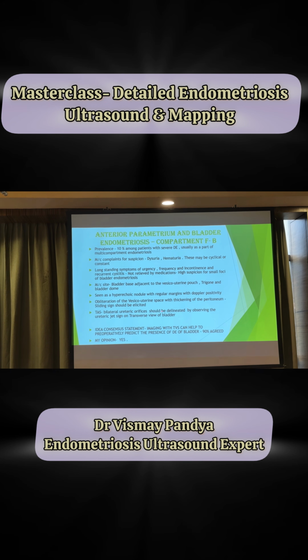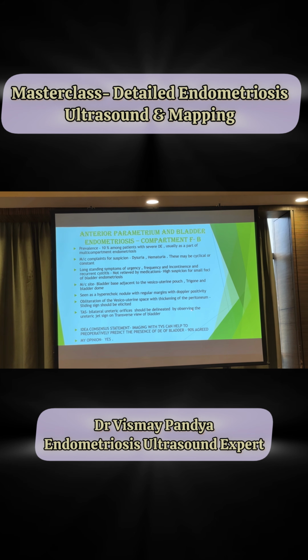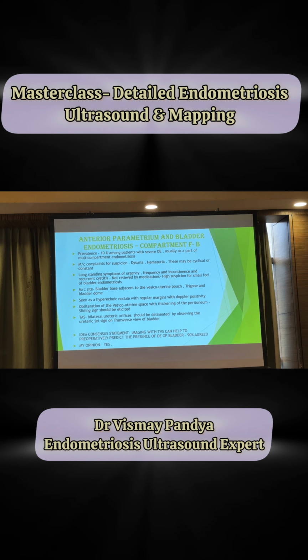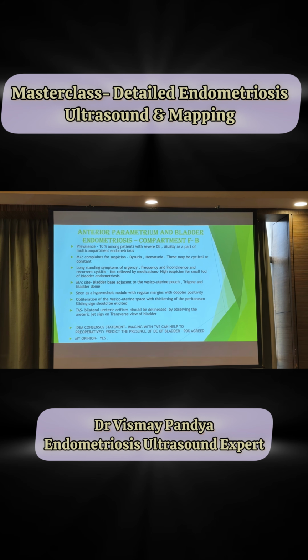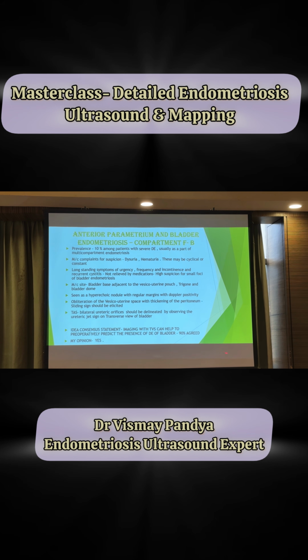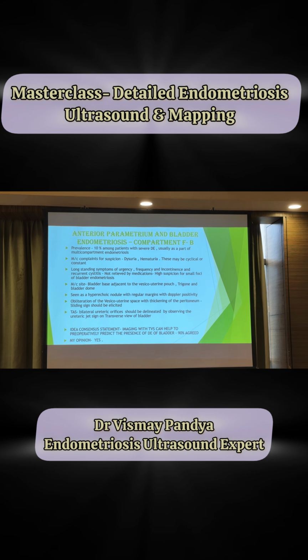And of course, if you see the nodule and you see the ureteric jets, you are very sure that it is at the level of the trigone. And if you see that the ureteric orifices and the nodule are separate, you can be very sure that the trigone is not involved. And the IDEA consensus also agrees that DE of the bladder should be diagnosed on sonography.